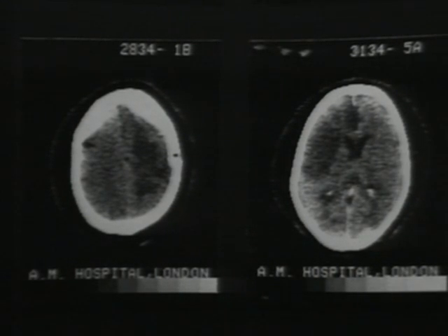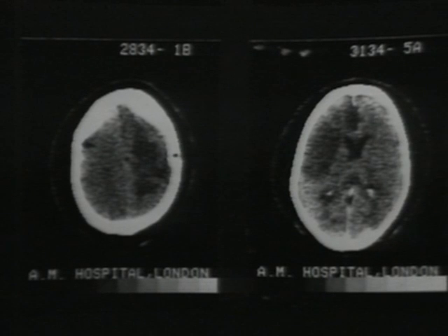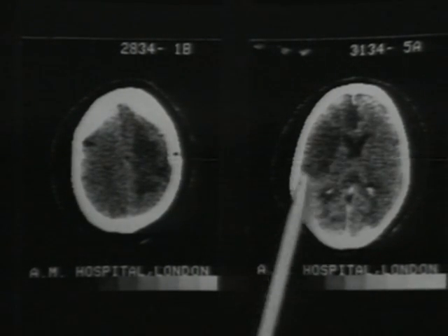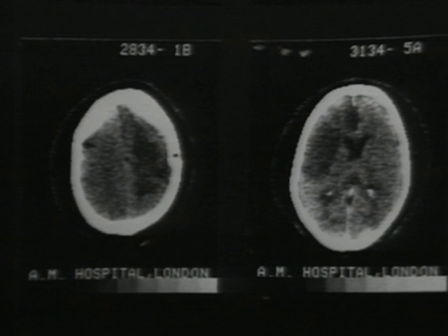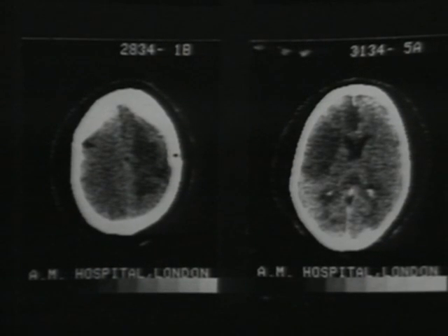If this patient had had a sudden incident which resulted in a right-sided hemiplegia, we would say that he or she had sustained a stroke, possibly an embolism, possibly a thrombosis, or even possibly a hemorrhage. Now, we know it isn't a hemorrhage because we can't see the density of the hematoma, but we see a large, well-defined, low-density area, and this indicates that the patient has, in fact, sustained an occlusion of a major vessel, and this is the infarcted brain showing up as an area of low density.